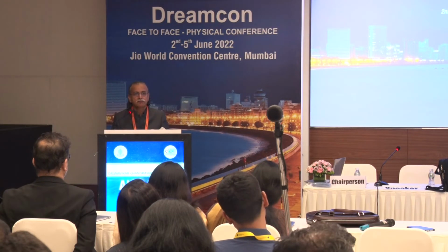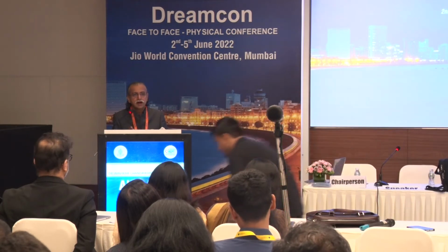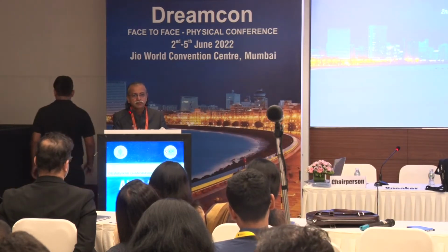From the other side, I'll try to put some visco, stop the irrigation, then go underneath the nucleus and put the heavy cohesive visco underneath, and I'll try to put the nucleus pieces in the angle shelf and then take them one by one.